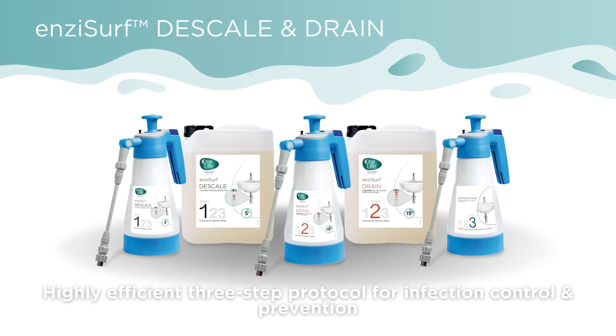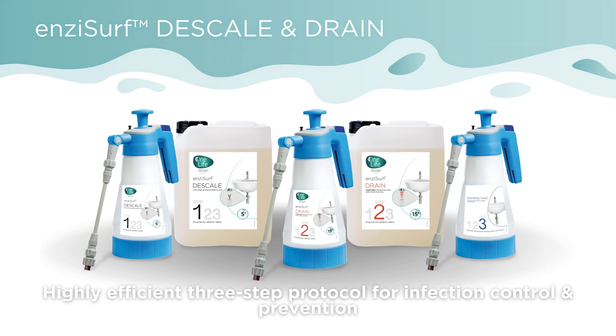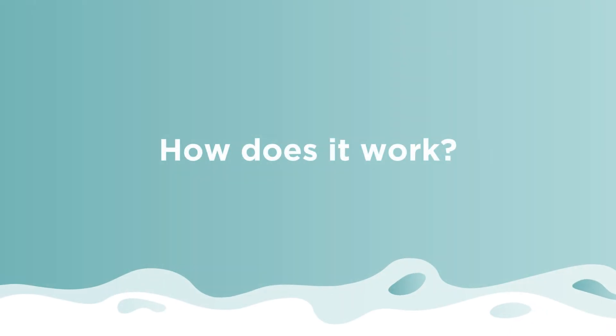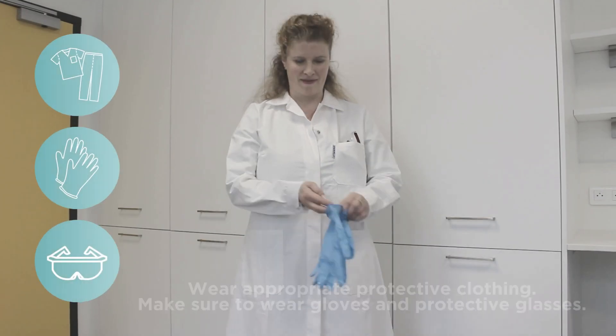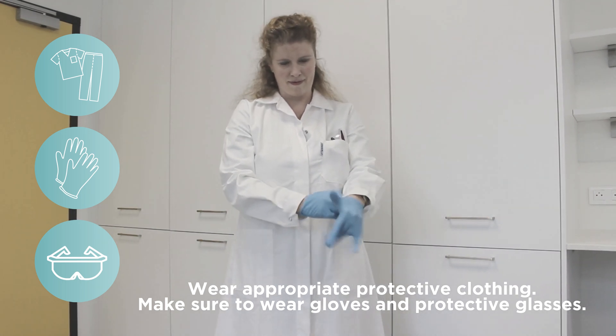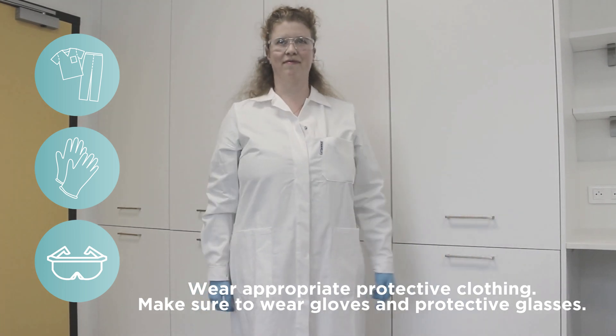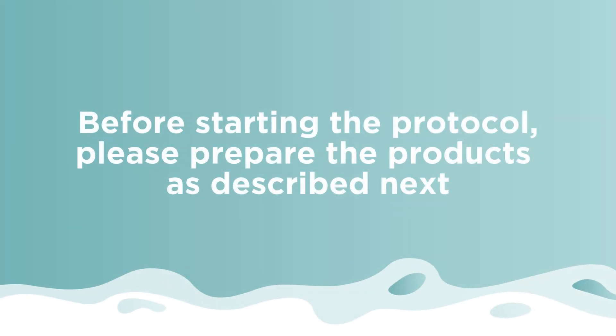Enzacurf descale and drain is a highly efficient three-step protocol for infection control and prevention. Before starting the protocol, wear appropriate individual protective clothing — make sure to wear gloves and protective glasses.